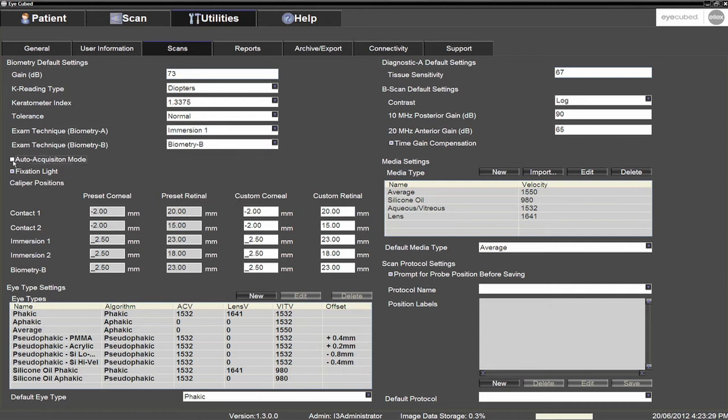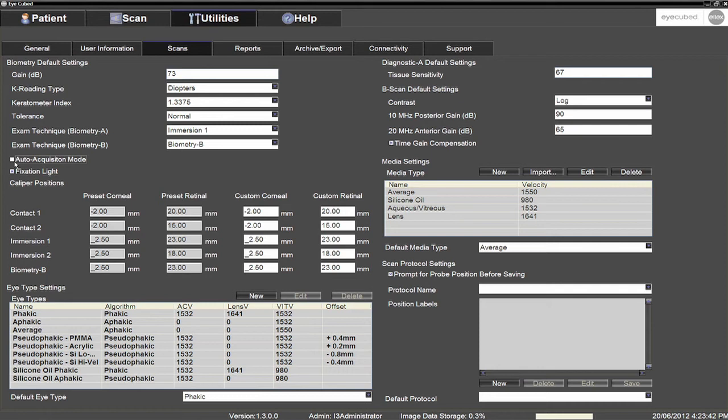And last, tick Auto Acquisition mode, which will enable the system to automatically save the scans in biometry mode in the presence of what will be analysed as good measurements. Alternatively, you may leave this box unticked if the user's preference is to manually save scans.